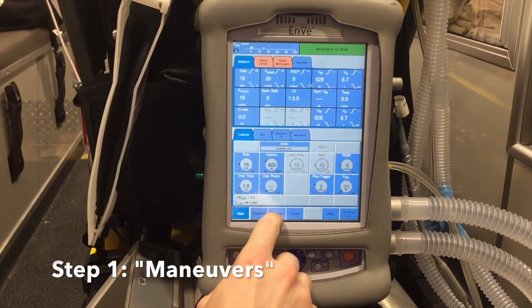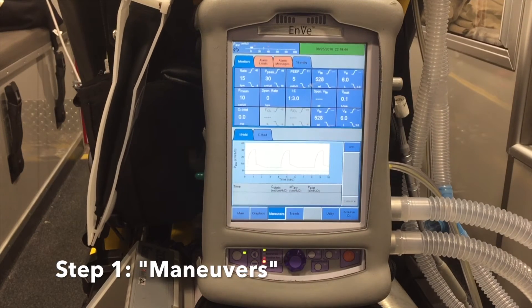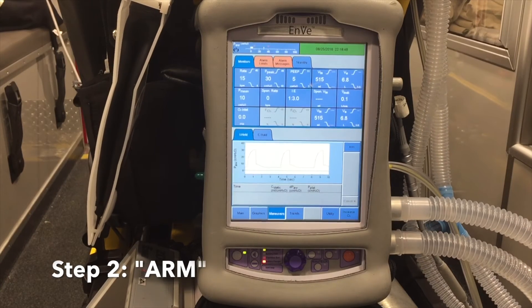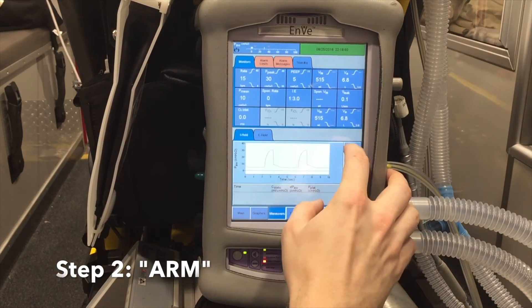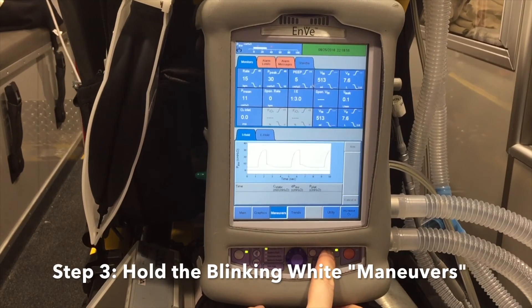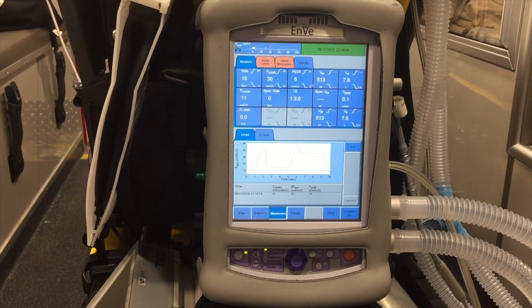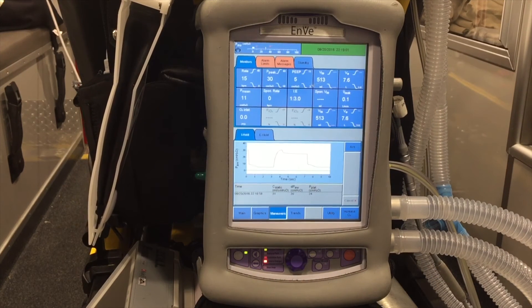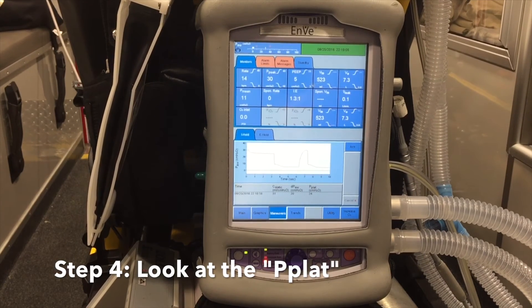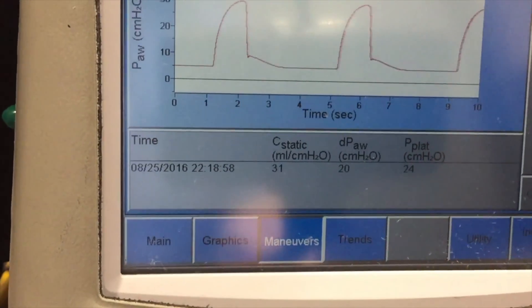The first step is to hit Maneuvers. After you're in the maneuvers screen, you'll see on the right side there is a button that says Arm — you want to arm this I-hold. After you hit Arm, you'll see a light start blinking on the bottom; that button is also called Maneuvers, but it's the white blinking maneuvers button. You'll see it's holding a pressure, and when you release the button it releases the pressure. It then displays a P-plat pressure on the right side. Let's take a closer look.